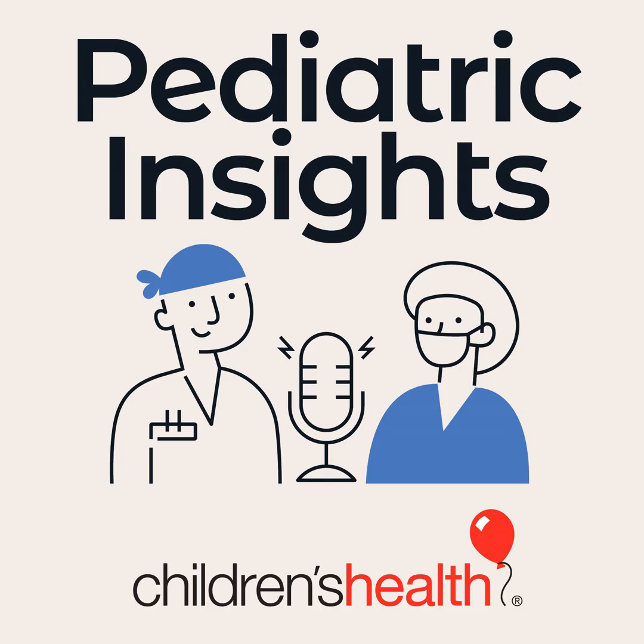A lot of times we're faced with not only that the heart hasn't developed completely well, but sometimes in very specific cases like hypoplastic left heart syndrome with intact septum, not only is the heart a one chamber, but also the way from the lungs down to the heart is not well developed, which makes the lungs also not completely developed. Having the fetal cardiac MRI will help you not only look at the heart, but also look at the lung and assess the lung edema or swelling and make sure it's not so significant that you really may end up changing the plan.